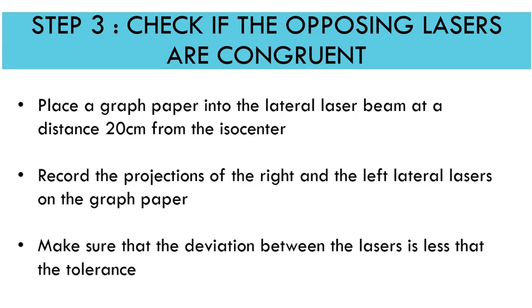Step three is to check if the opposing lasers are congruent. Place a graph paper into the lateral laser beam at a distance of 20 centimeters from the ISO center. We already confirmed they meet at ISO center — now we check what happens off axis. Record the projections of the right and left lateral lasers on the graph paper and make sure the deviation is less than the tolerance specified by TG 142.